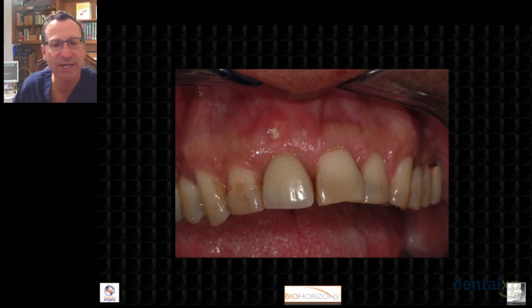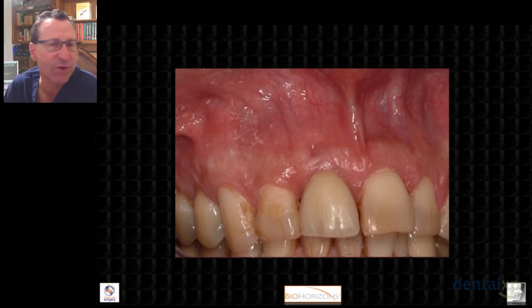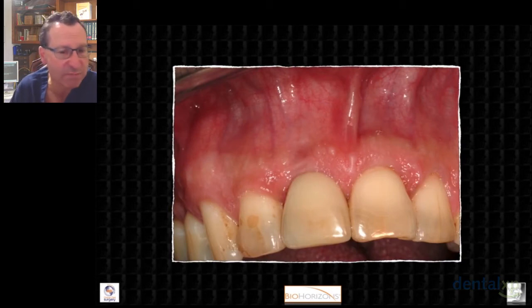You can see that our collagen membrane is kind of poking through, that it's starting to break down. At about 4 weeks, the collagen membrane has broken down further. It's starting to epithelialize over. And then this is the patient's final restoration about 4 months post-placement. And you can see that the soft tissue defect has filled in completely. We have good mucosal contours, good mucosal health, great aesthetics.